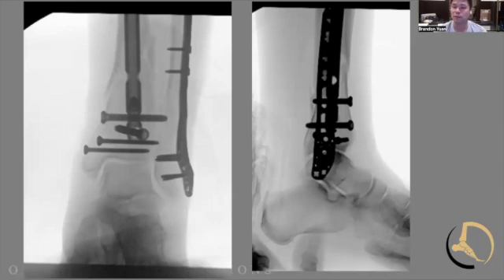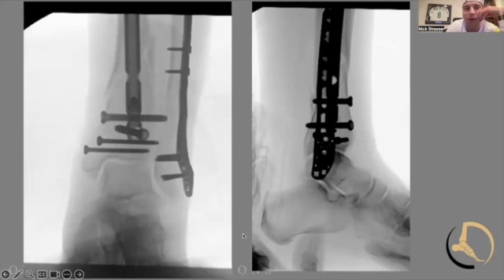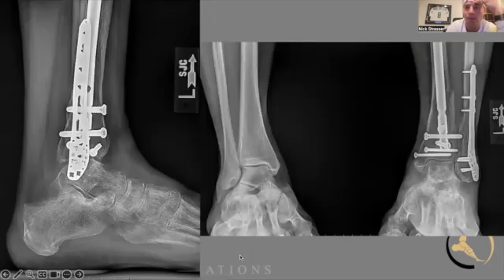The interesting thing about this particular case is that - probably should have recognized it before - it ended up having not only the distal tibia and fibula with that medial malleolar component, but also a couple of non-displaced fractures in the midfoot and then a proximal fibula fracture as well. So to that point, there was definitely a rotational component to it - the whole shebang.